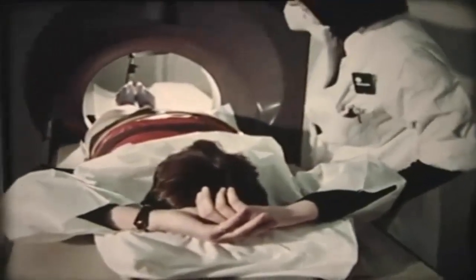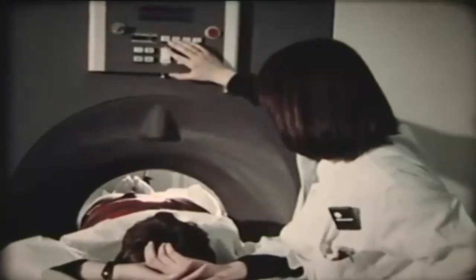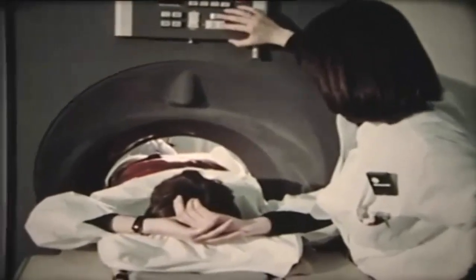So that's the challenge for the physicians. Many institutions around the world will be making those evaluations. With new improvements in technology and new improvements that we find as physicians, I think we'll be able to demonstrate soon very many uses for CT to nearly every patient with disease. The challenge to us as physicians, and to the companies who are providing the equipment, is to make this a more important procedure, both in diagnosis and therapy — that is our challenge for the future.